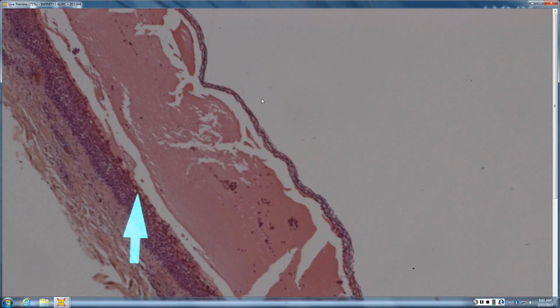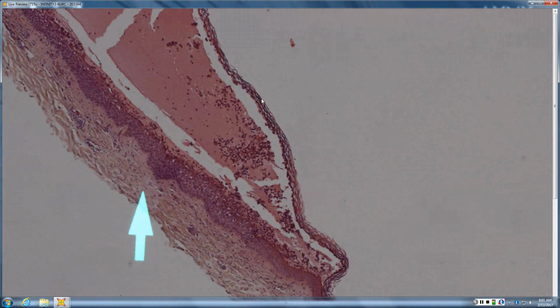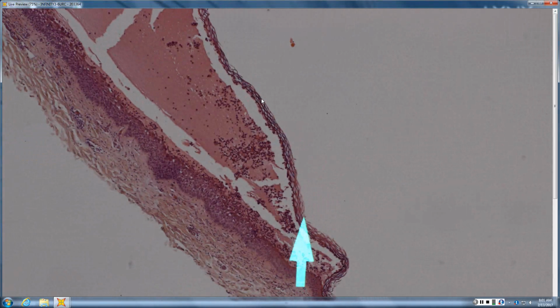So we have some serum crust and some pustule. Serum crust and pus, and the pus is kind of within the layers, subcorneal. Yeah, so subcorneal pustule, what is your subcorneal pustule differential? Oh yeah, like AGEP.